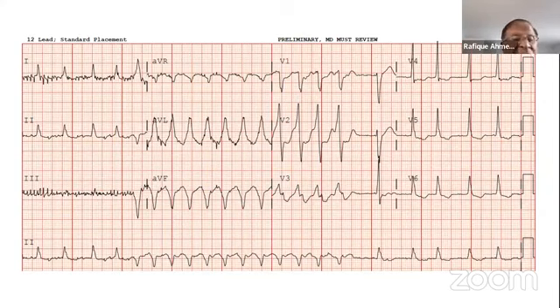But then you look at lead two. If it were aberrant right or left bundle, the pattern should not be like this. It changes completely, number one. The other thing, quickly look at lead V2. If you look from the beginning of the QRS to the deepest point of the S wave, it is more than 100 milliseconds. And that goes with VT.